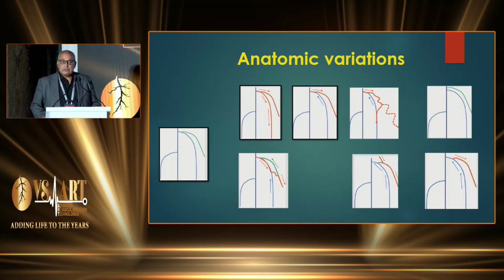And there are 2 rare types. The upper one ends by a separate opening at the femoral vein, and in the other one the axial reflux comes from upward. This is the ascending theory. So if we ablate the anterior accessory vein, we can be sure that we deal with at least more than 90% of the recurrence at this saphenous region.